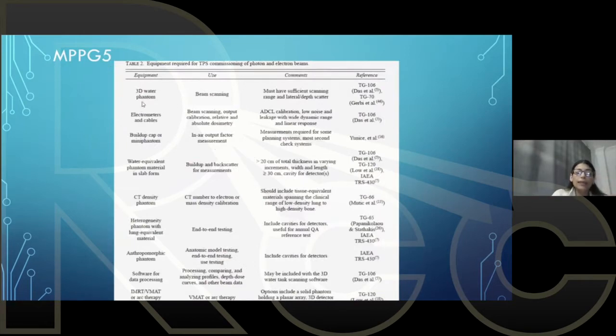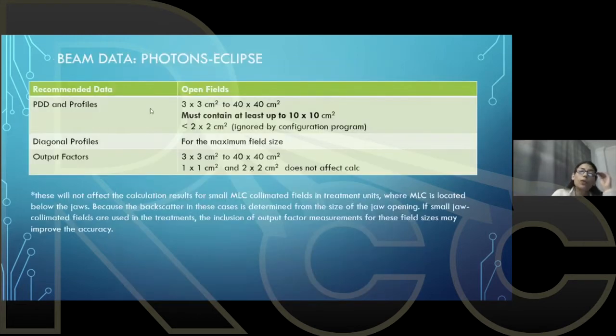And also they provide some recommendation based on the equipment that you need. And we review the equipment that you need and that I use, for example, in my clinic in our previous session. So for example, for ECLIPSE, in my clinic, we are all Varian. And I have to say that I don't have any economic interest in Varian. So this is a full disclosure. I'm not encouraging that you buy Varian products or anything. This is just what we have in my institution.